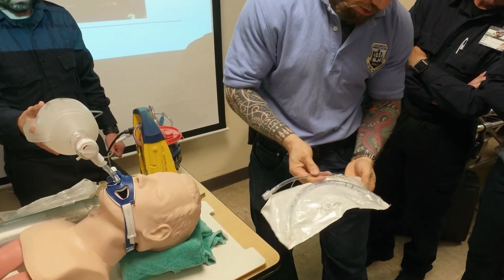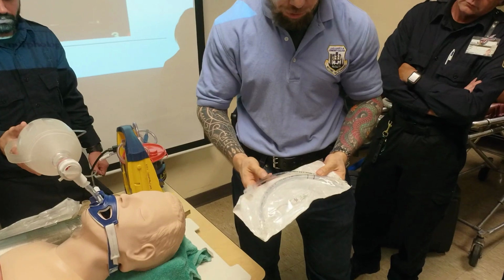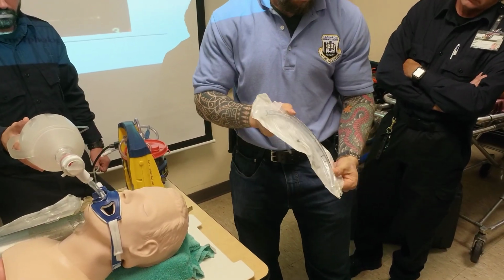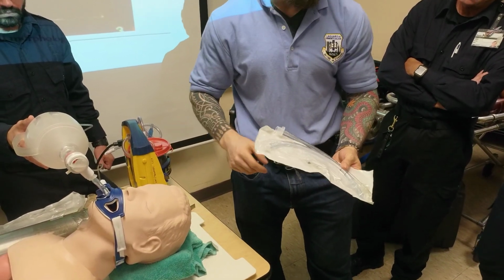I have more impedance. I may have my partner have 2 tubes ready by my side, and I may see once I go inside what I see. Do you measure the tube? The tube? No. Is there a way to do that? Yeah, you will see once you go in.